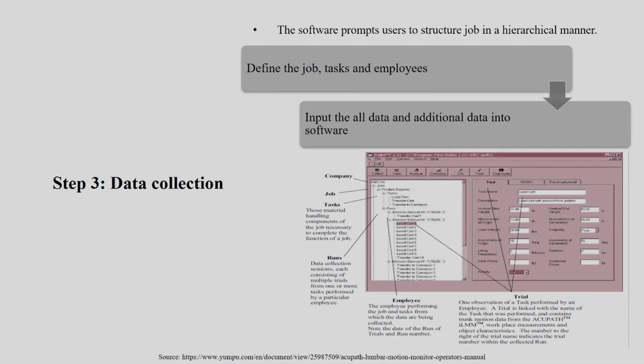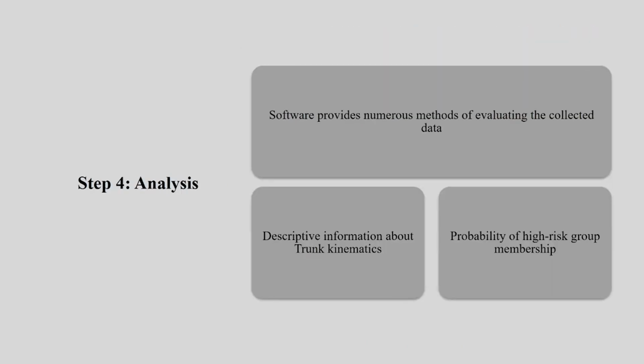Again I would like to mention, it is not available, so everything is a screenshot from this particular manual. The software prompts users to structure the job in a hierarchical manner. So what is happening? Define the job, task and employees, and input all the data and additional data into the software. You are going to give all this information in these places, and you will get the results after that once you start the data collection.